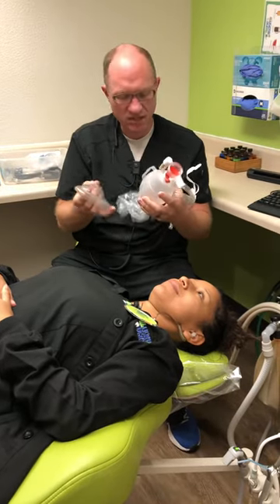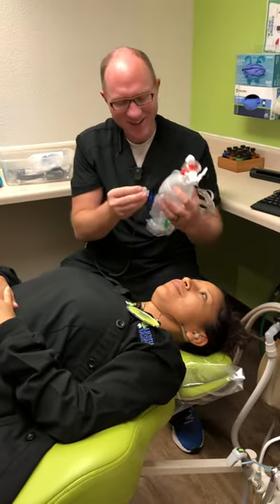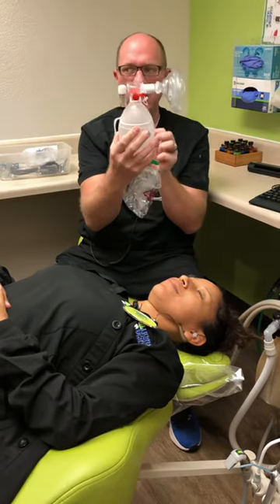That mask comes along and it attaches — it hooks in right here. So it then becomes attached like this.